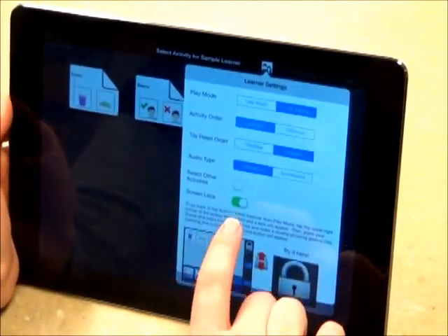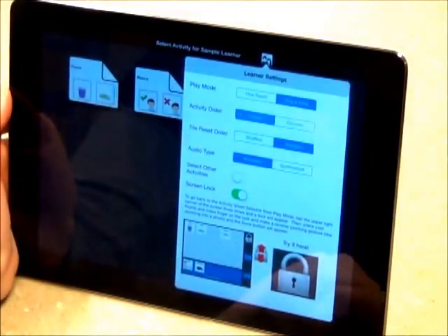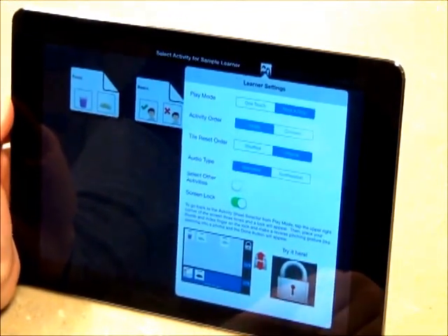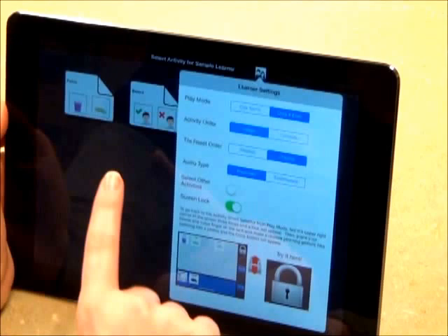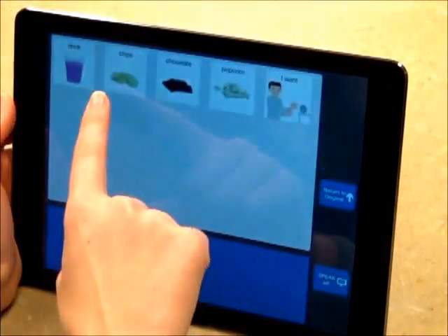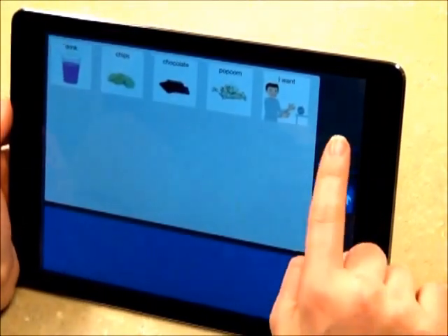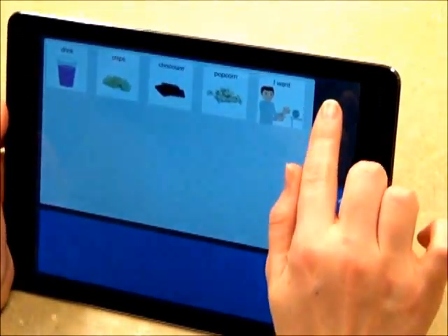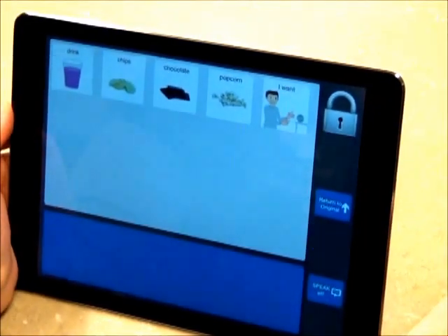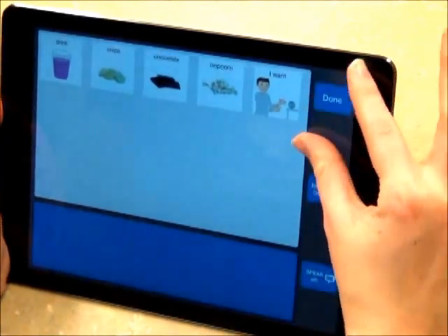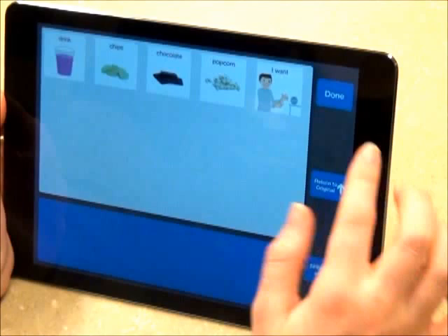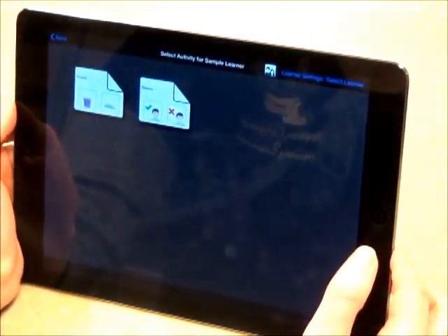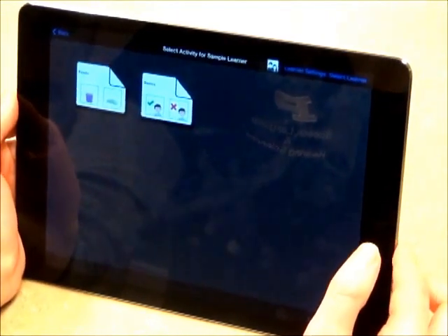When I turn on Screen Lock, the directions automatically appear. We recommend that you practice before actually entering an activity sheet with screen lock on. You will notice that the Done button is no longer present in the upper right-hand corner. So you must tap three times, then a lock will appear. Then make a reverse pinching gesture and the Done button will appear, allowing you to exit the activity sheet. This makes sure that learners cannot exit activity sheets while they are working.